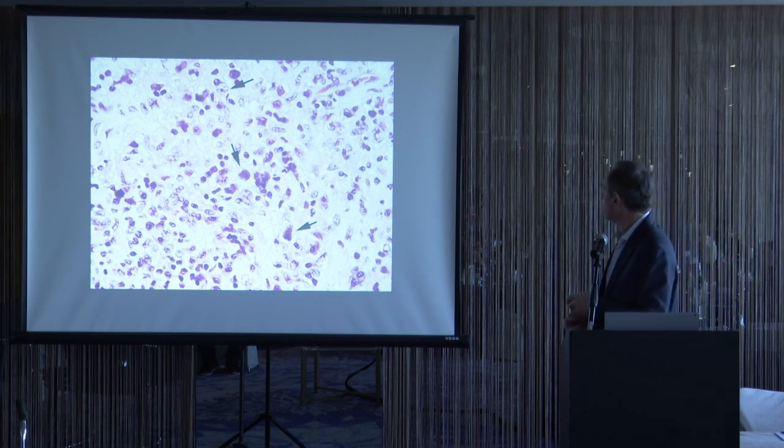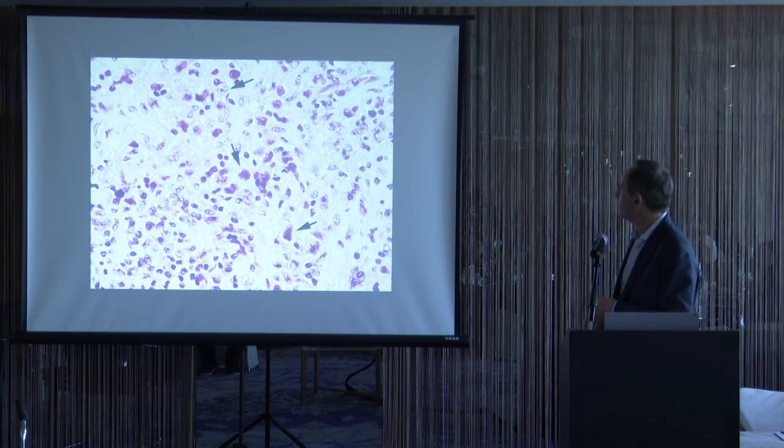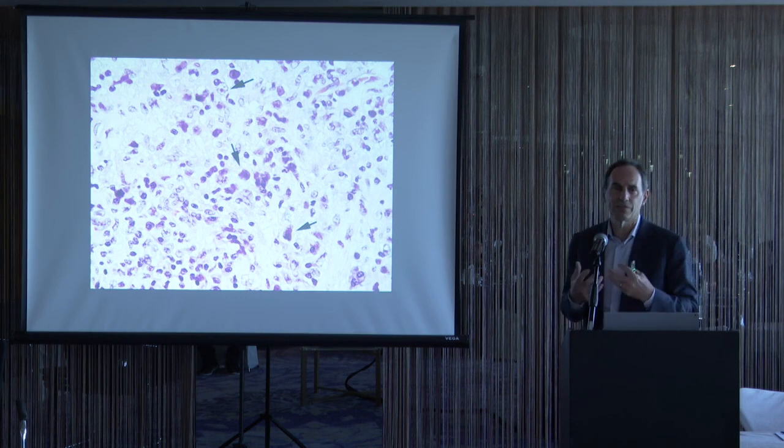So here's a case where we have a lot of granulomatous inflammation, which are these pale cells, these more delicate open chromatin histiocytes. And here we see a classic seminoma cell with big prominent nucleoli. But what one has to also recognize is that seminoma cells are very fragile.